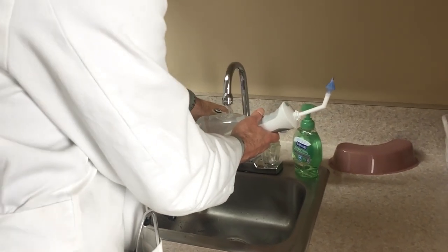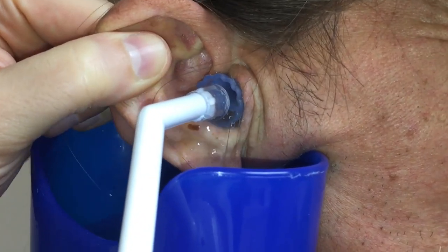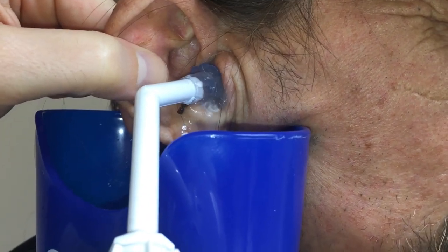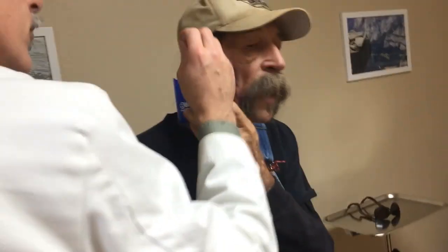Pour some hydrogen peroxide in here for number two, and then some hot water. It changed tone — why did it change tone? Oh, look — maybe it's because it's hanging off of the tip. It might even sound a little different when I talk. I think that's why it sounded different, because it got the obstruction out. My form-fitted ear plug is no longer form-fitted.